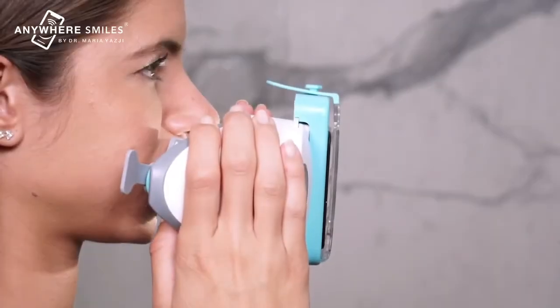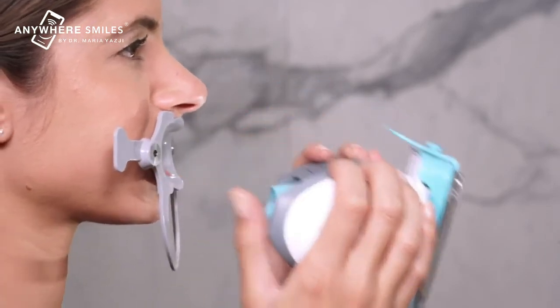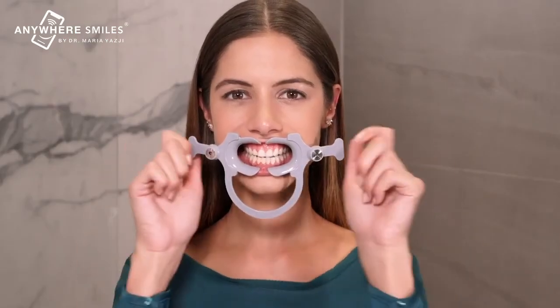To remove the ScanBox, hold the retractor in place with your thumbs and pull the box forward. Then remove the retractor. That's it. Now it's your turn to try out your first scan.